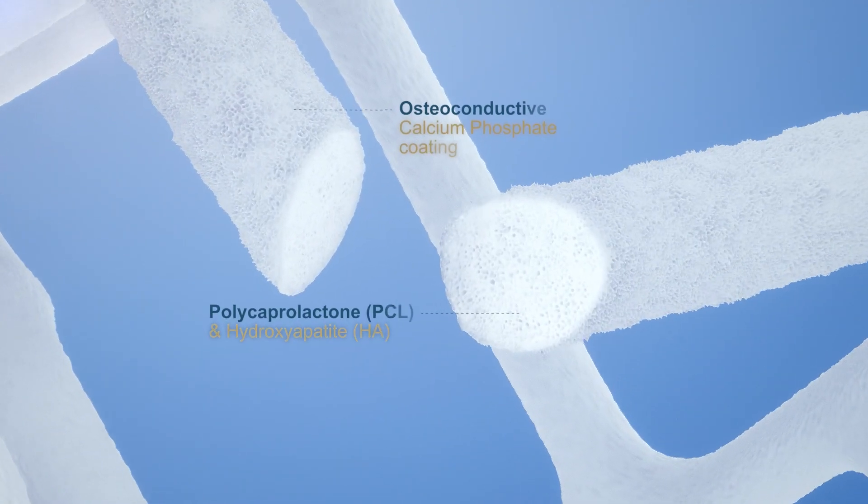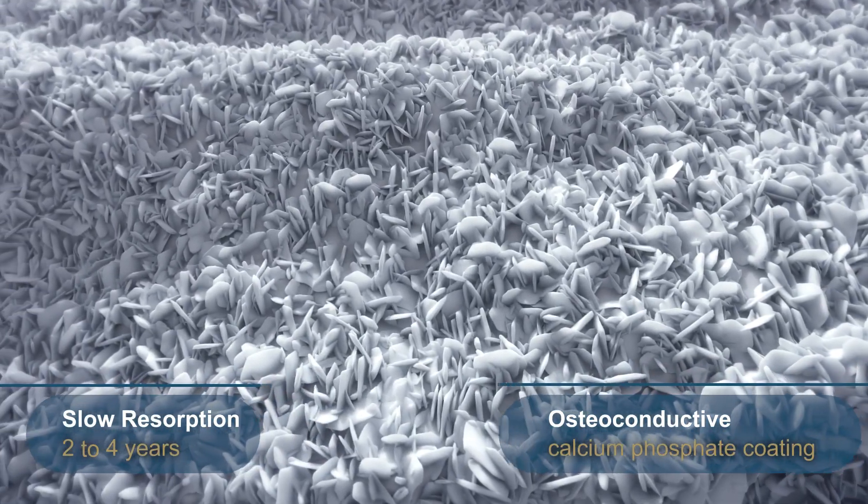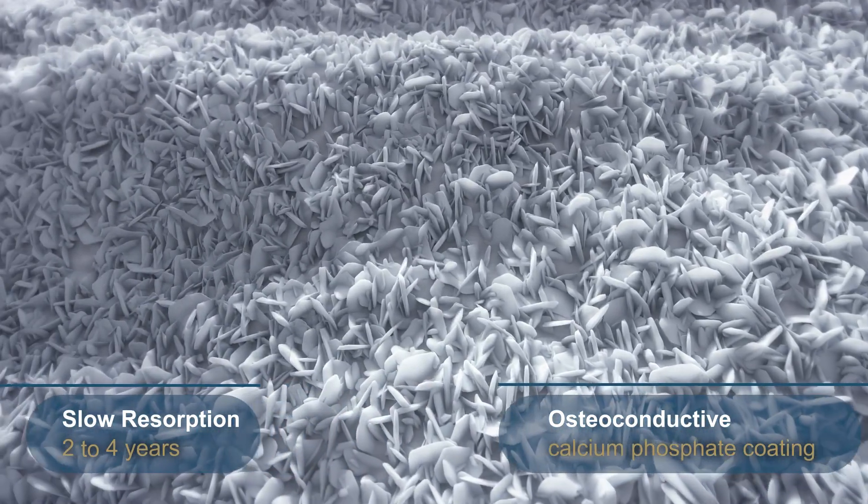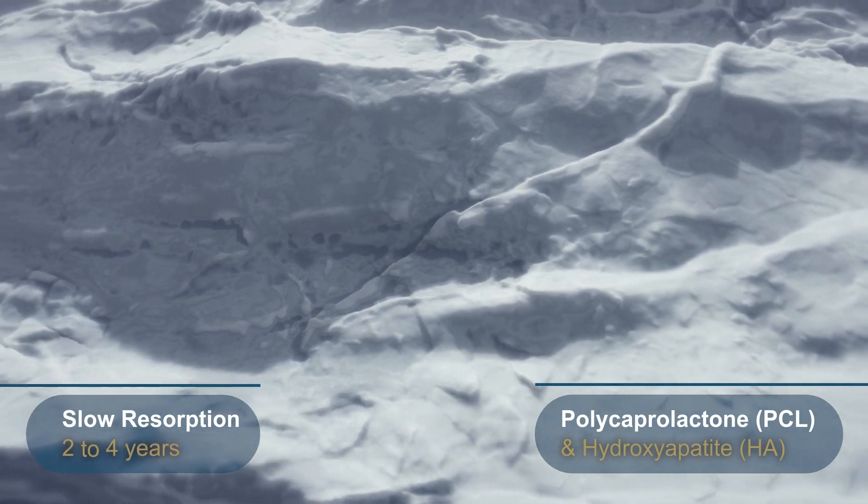The device is also coated with proprietary calcium phosphate, which gives the graft cage an osteoconductive surface and facilitates cell attachment for the formation of new bone.